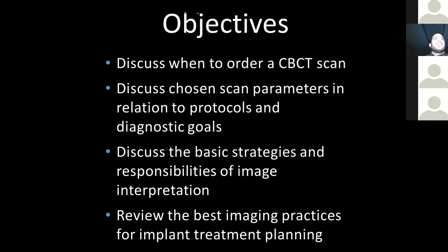And I'll build on that discussion a little bit. The things you need to consider is, are you going to do just a quick alveolar measurement and you just need to see where bone and the canal space, some critical anatomy is, or are you actually doing a guided surgery where you need a little cleaner scan? And you can also incorporate the technical recommendations from whatever guided surgery protocol you're working with.